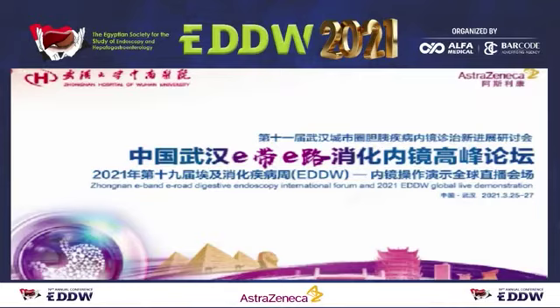Hello everyone, I'm Dr. Ge from Zhongnan Hospital, Wuhan University, and this is Dr. Zhou. Today we are going to show the process of the magnetic control capsule gastroscope. We will use this little handle to control the position of the capsule. Dr. Zhou will show us later, and now let's do the preparation first.